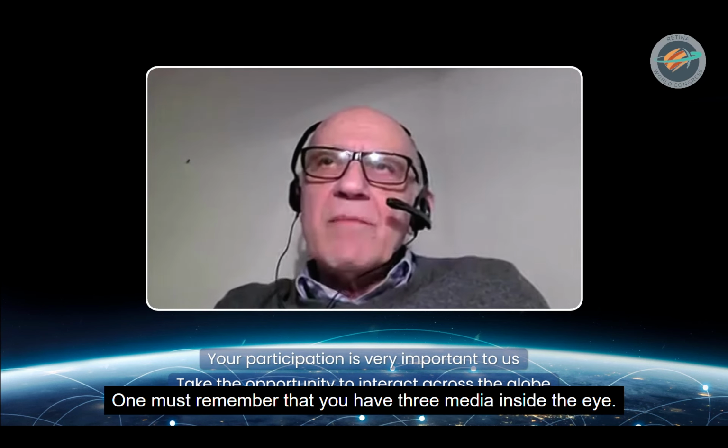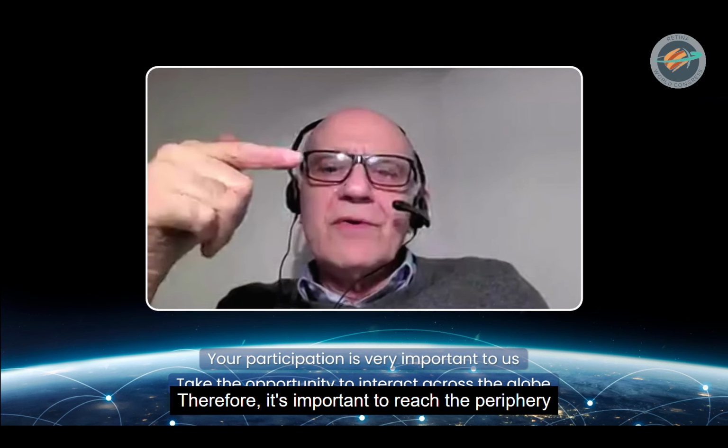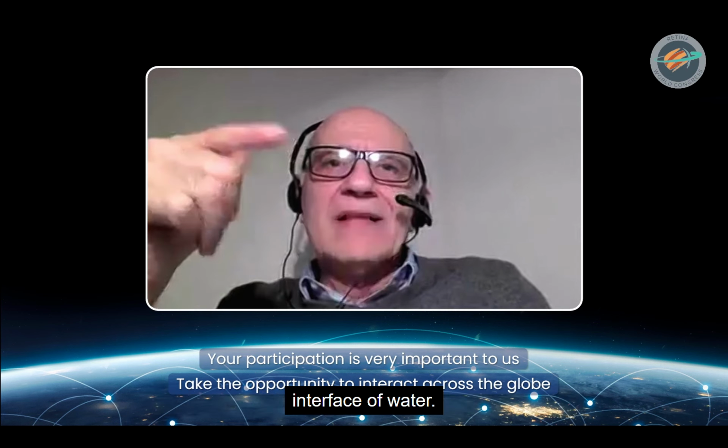One must remember that you have three media inside the eye. You have the silicone oil, which is coming from the top. You have the perfluorocarbon, which is sitting on the retina. But in between the two there is obviously still some water, some BSS. Therefore, it's important to reach the periphery as the silicone oil is going in, so that you remove that interface of water. Otherwise, your retina will roll up, it will slip, and you will be very unhappy.